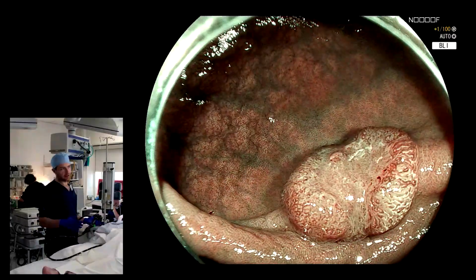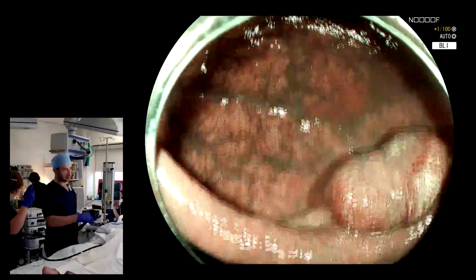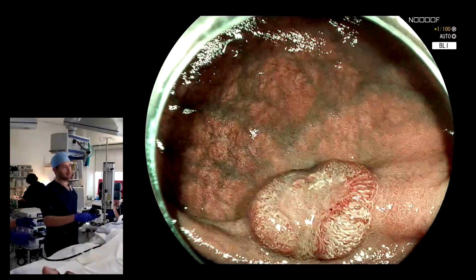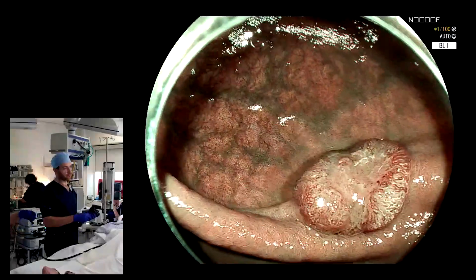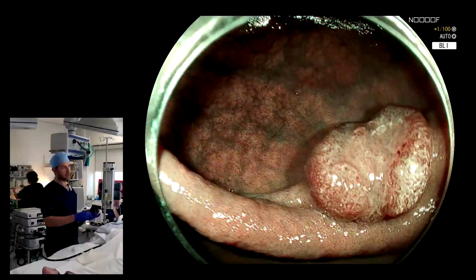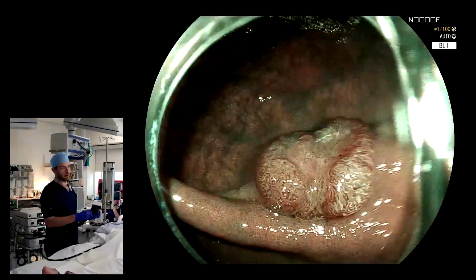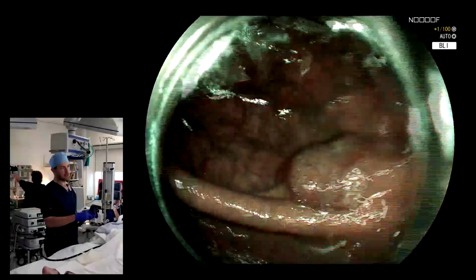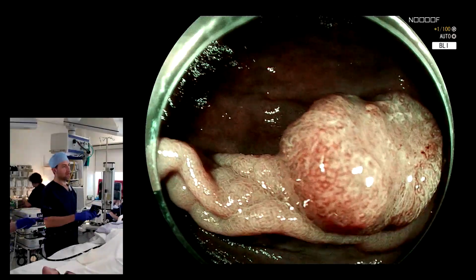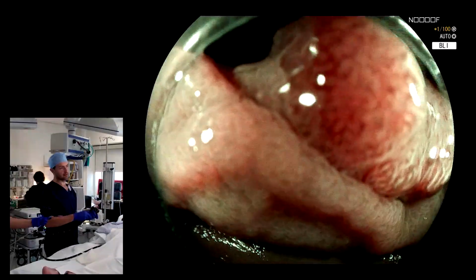And in this case, because we are in the transverse colon, we can remove this lesion en bloc with the full thickness resection device. The only possibility is that this device does not pass the sigmoid. In elderly people and those with comorbidity, often they have associated diverticular disease or stricturing of the sigmoid colon. This can be a downside of this device, and if it doesn't work, soft coagulation please. We will of course try passing it with the proof cap, or the cap of the device, which lets you test whether you can pass first. If we cannot pass, then we will obviously not open the device, which is relatively expensive, and we will use another technique, such as ESD.